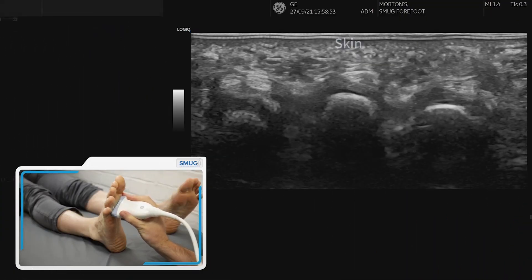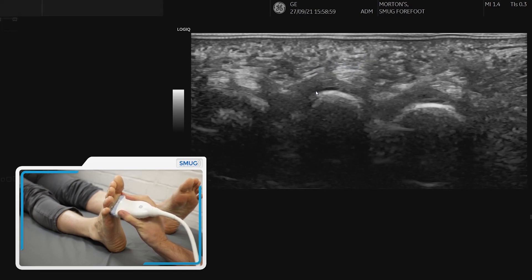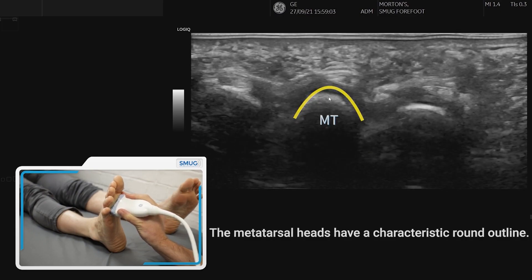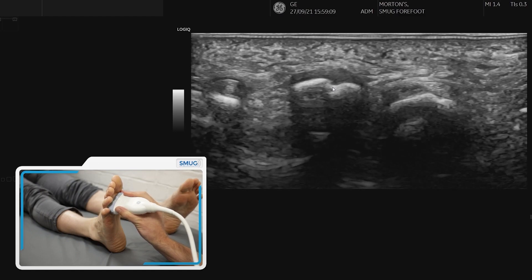To assess for a Morton's neuroma we're going to look at it from the sole of the foot. The first thing is to identify in transverse section the metatarsals. You can see the metatarsals are nice and round, whereas if I move distally you can see the phalanx is slightly flatter, so that's a nice bony landmark to look for.